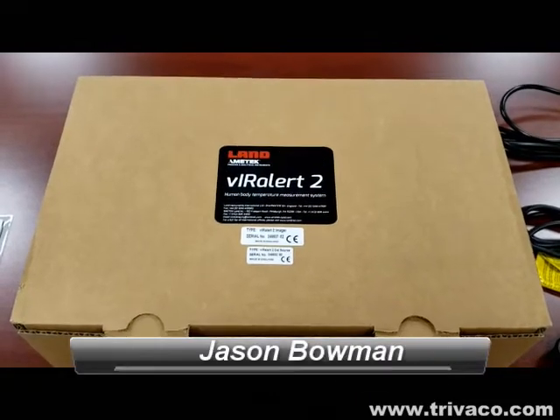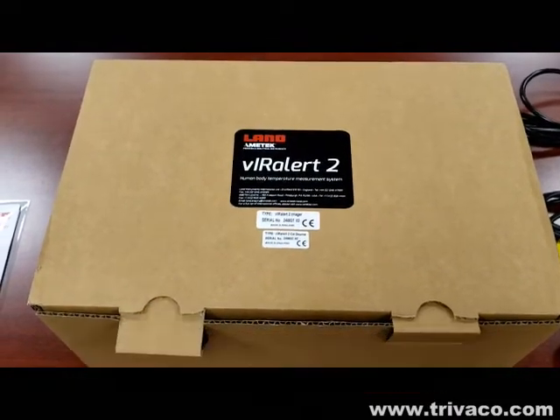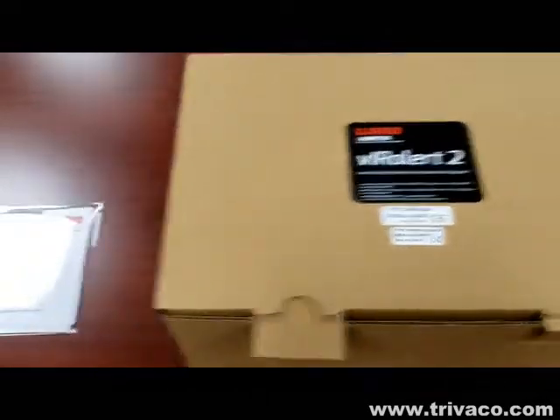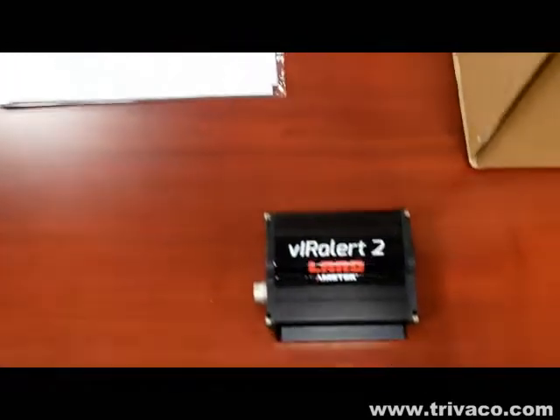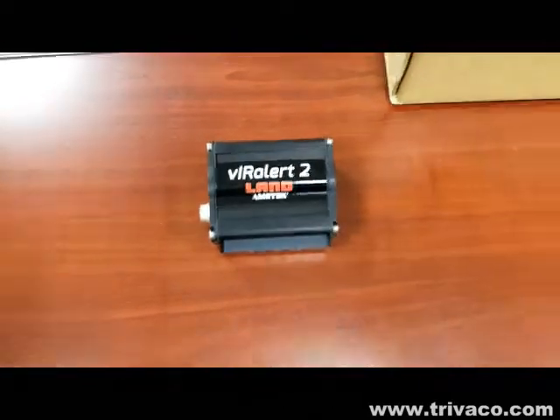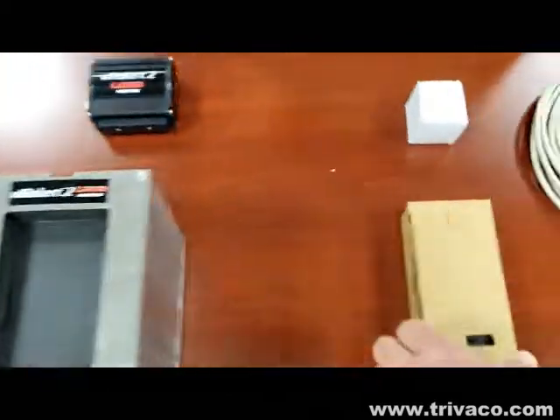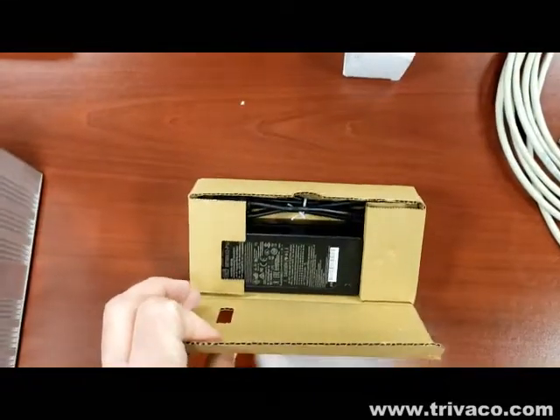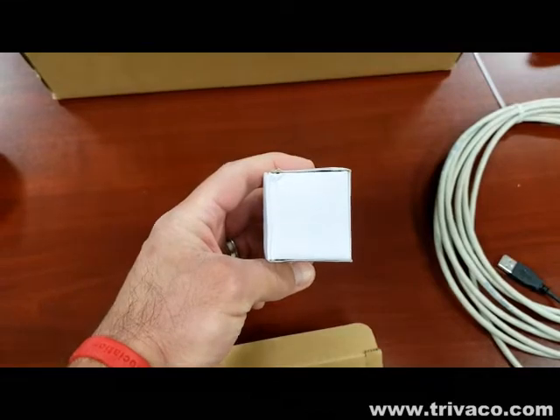Good morning, Jason Bowman with Trivaco. We've received our Land Viral Alert temperature screening system. In the package you'll get calibration certificates, a thermal imager, calibration source, 12-volt power adapter, and a tripod mounting accessory for the imager.